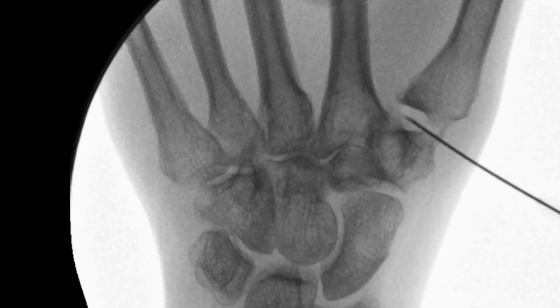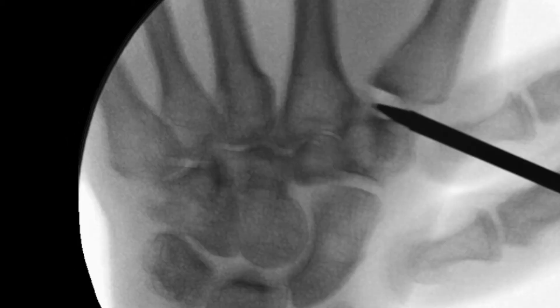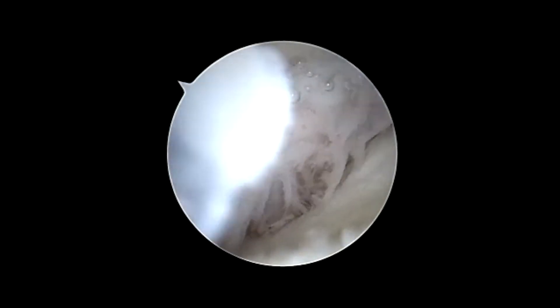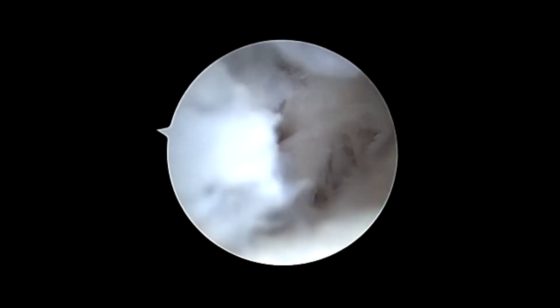Mini C-arm fluoroscopy is used in order to develop the standard 1R and 1U portals at the thumb CMC joint. An Arthrex 2.9 mm arthroscope is placed into the thumb CMC joint, and an initial evaluation of the joint is performed.